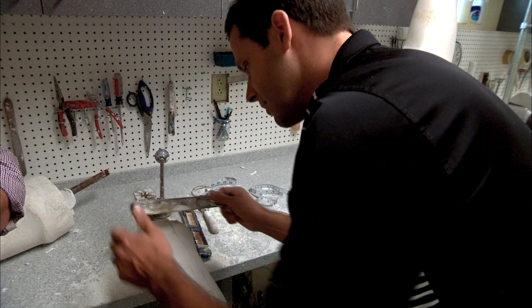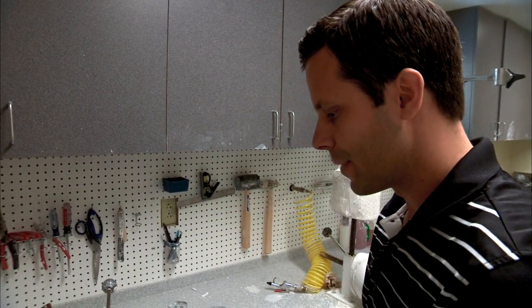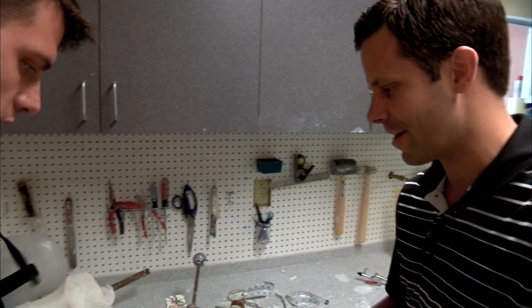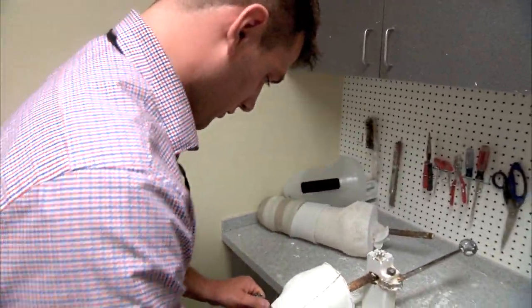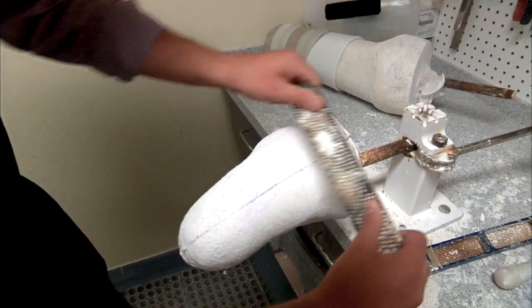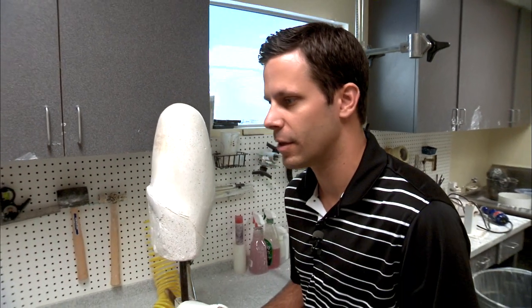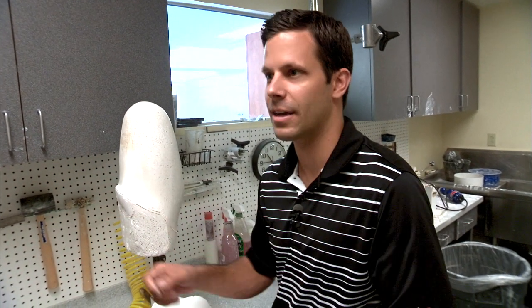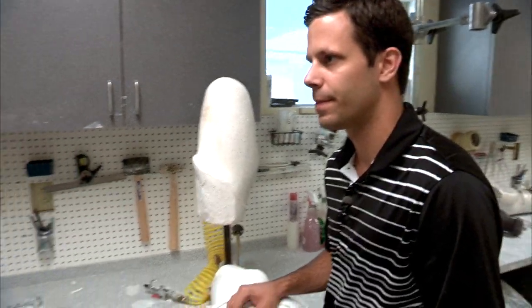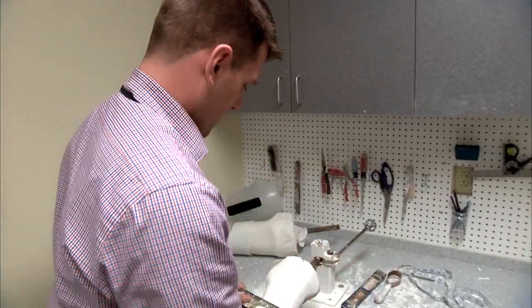We've taken some measurements during the casting phase and we can go ahead and try to achieve those. As much as this is a science, it's also a little bit of an art form. Once we've got the mold modified down to our measurements, we're going to take this into the oven room and pull the check socket over the top of it. Oven room sounds exciting — once this gets done, we're ready to go.